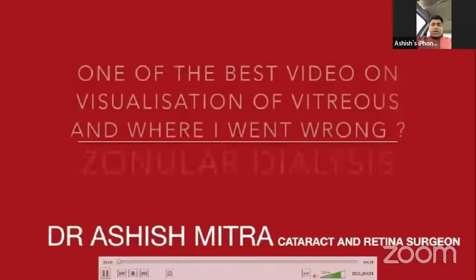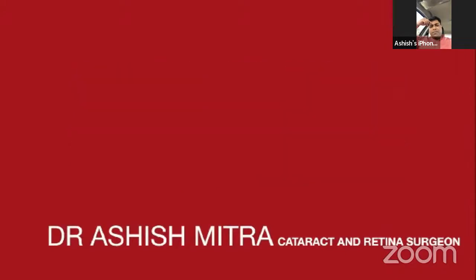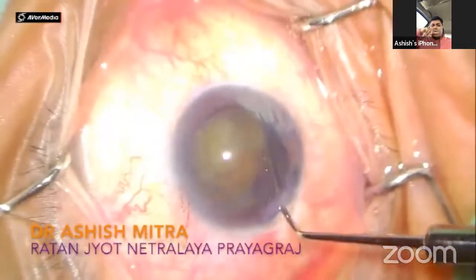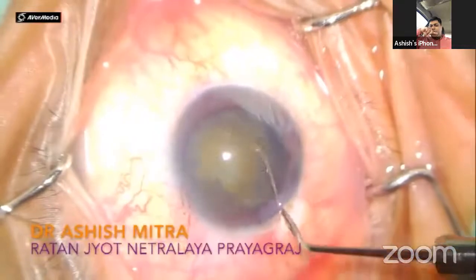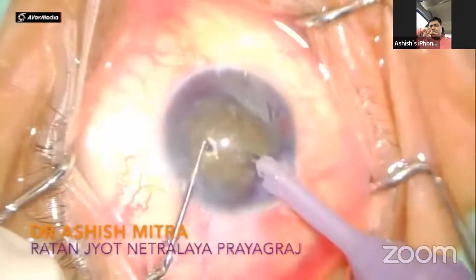Thank you, Dr. Chitra. Hello ma'am and everyone. Thank you for giving me this opportunity to present a video of zonular dialysis where you can see vitreous very beautifully and where I went wrong. It is always very important to analyze your complications so that you can rectify them in your future cases. This was a hard cataract with that metallic sheen which I have discussed in my previous videos.